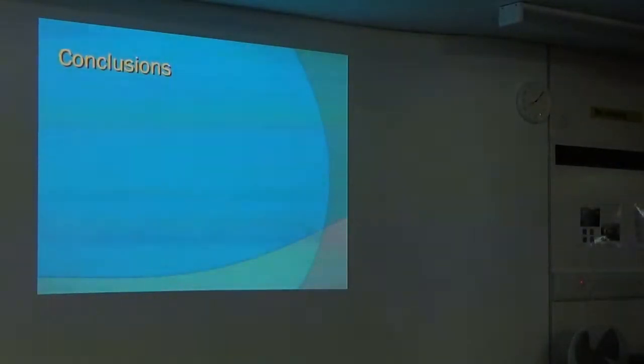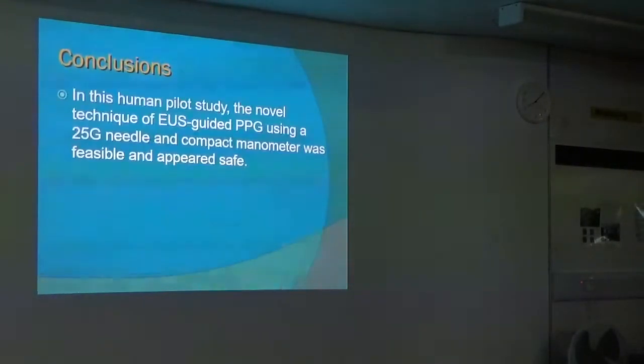If it turns out to be as safe as they're suggesting, so that you're more prepared to do it, you can envisage somebody being on treatment, say to reduce the pressure, and you can do a quick measurement to see whether it's working, because we know that some people go on to medication to a certain dose and it reduces the pressure, others need different medications, and you can actually measure that pressure potentially. But I think we're a little way from being able to do that routinely. And they concluded that it was safe and feasible.